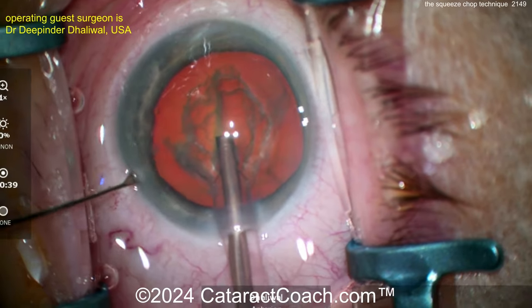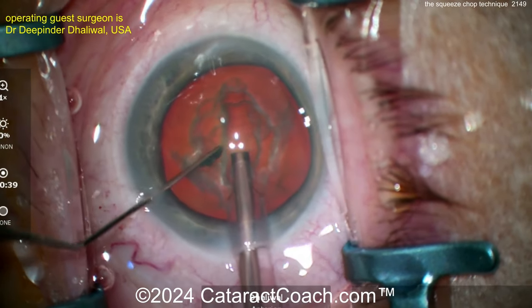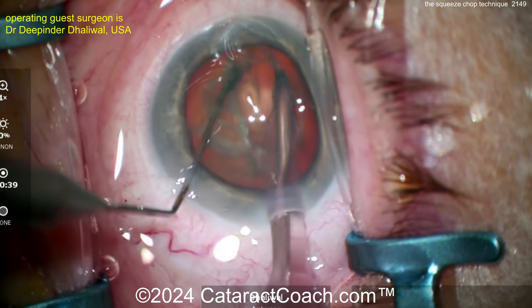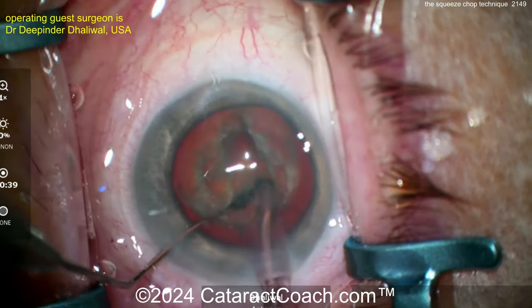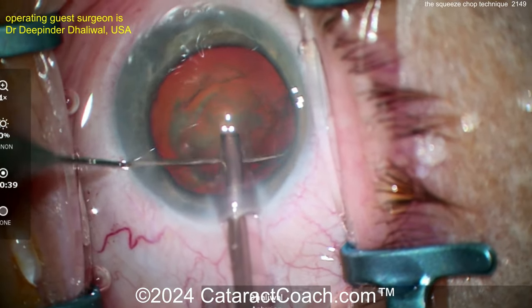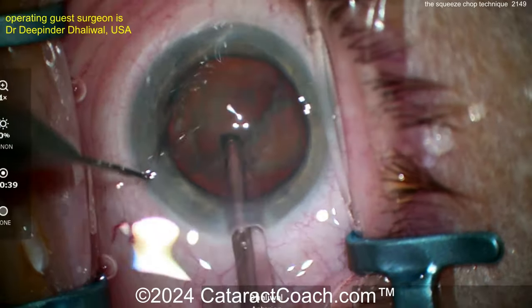Now a spatula goes in — you don't even need a chopper. Watch this: splitting the nucleus with the spatula, propagating that crack all the way down. Now you've got two complete halves. Once that's done, rotating the nucleus — and here's the squeeze chop technique.